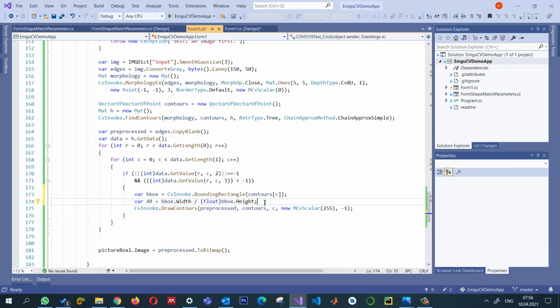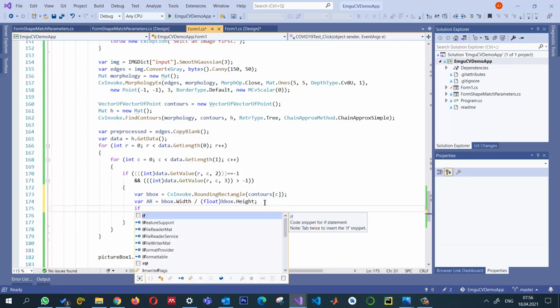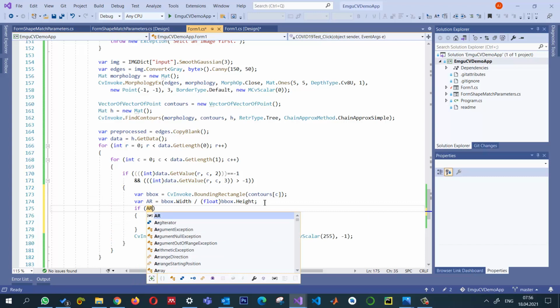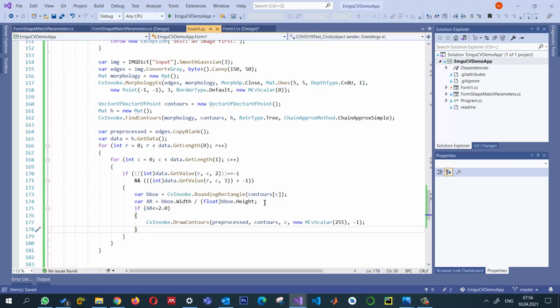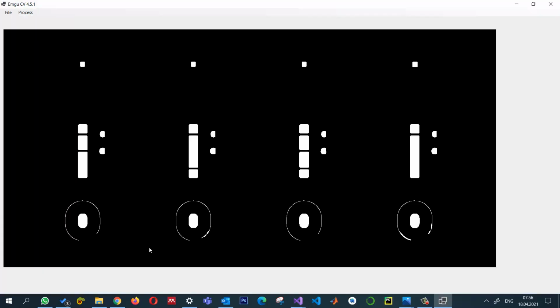Okay. And then we can put a condition here. If the aspect ratio is less than or equal to 2.0, let's say, then we can draw the contour. Otherwise, we don't want that contour. So let us see. I hope that some of them will be refined. So here you can see some of them have gone and only few are left, but we don't need the rest of them. Only these contours are required.